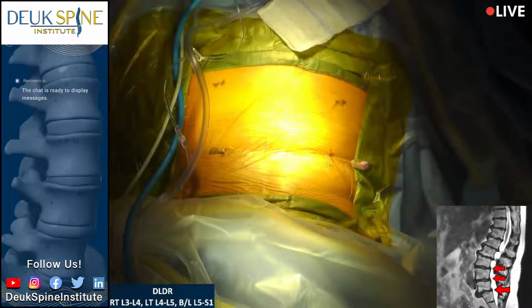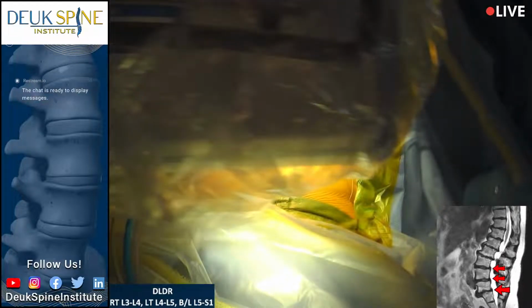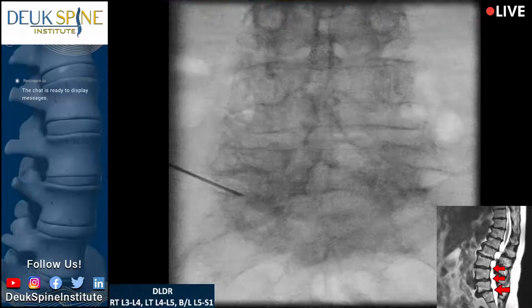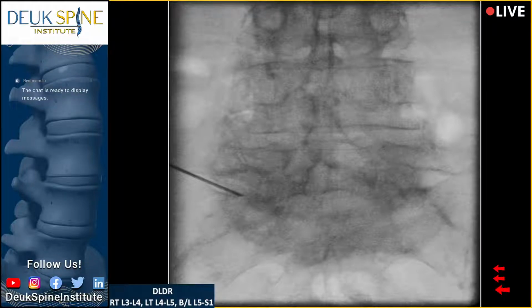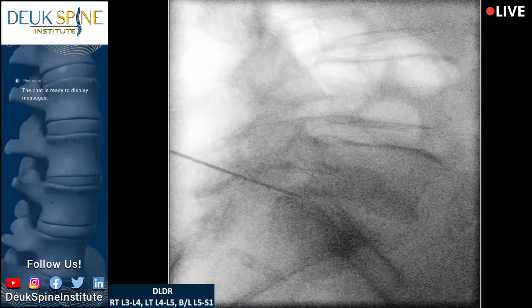So L5-S1 is the hardest disc to get into through the foramen. It's universally true for everybody in a lumbar spine. The easiest is going to be probably L4-5, L3-4, then L2-3. Yeah, it looks really good to me. We're right at the lateral border of the disc. So this is where her nerve is getting pinched the worst at L5-S1, by the way.